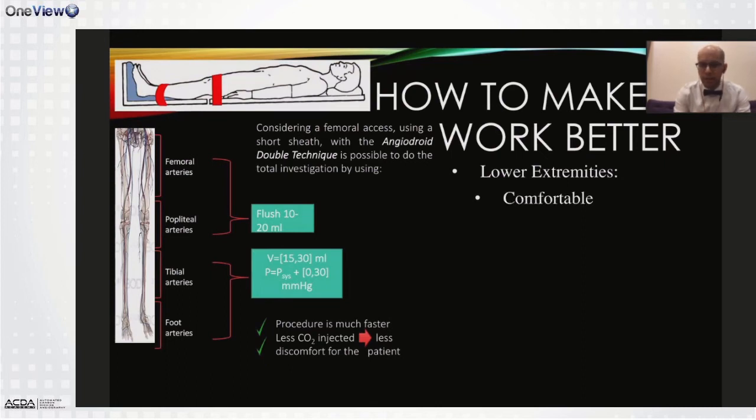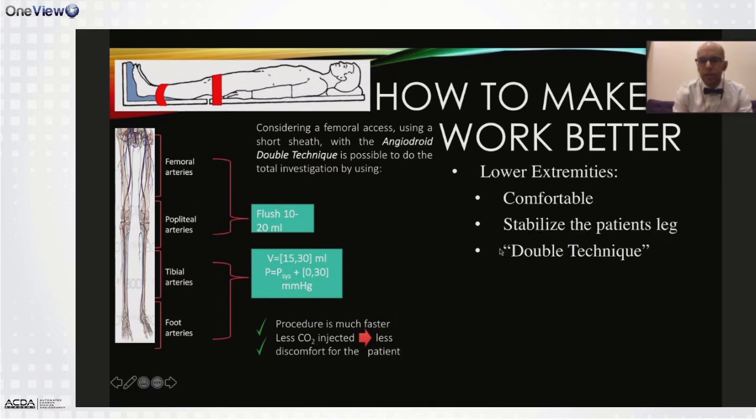make sure your patient is comfortable. Make sure you have the legs strapped if you can. I know Dr. Manzi has his specific techniques. I'm sure he's going to enrich us with it in a little while. There's also something called a double technique. So you don't always have to do a full injection with the machine. The machine has a flush function.